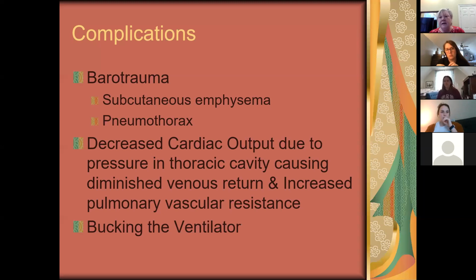Correct. Now, understand that bigger tertiary care centers like CMC, for example, I can't speak for Pineville and I can't speak for University or the smaller hospitals, but at a lot of tertiary care centers, respiratory sets the ventilator settings. The doctors write them as like, I'm kind of making this part up, ICU care 1.